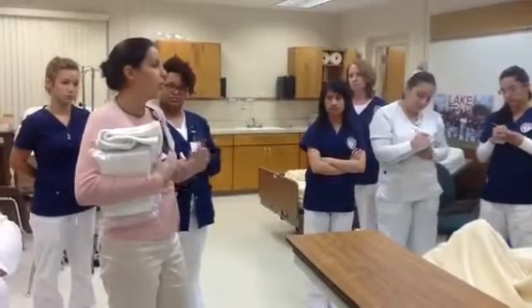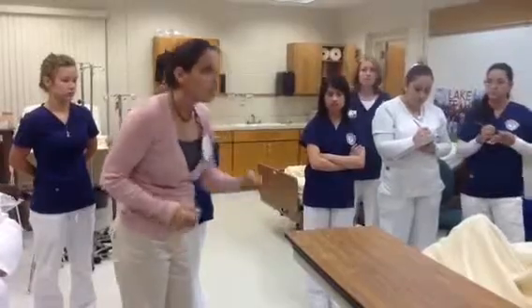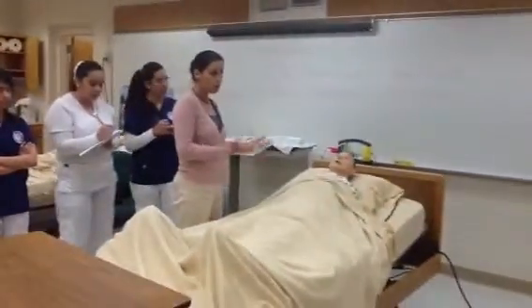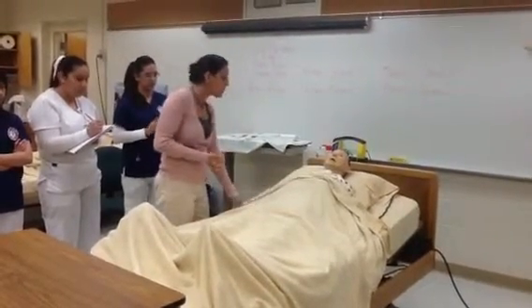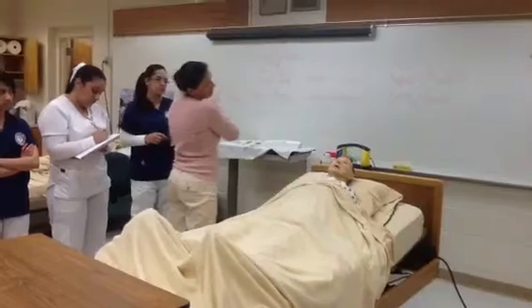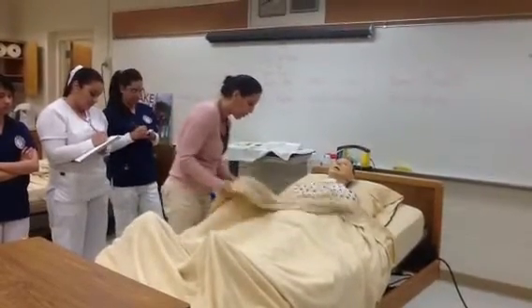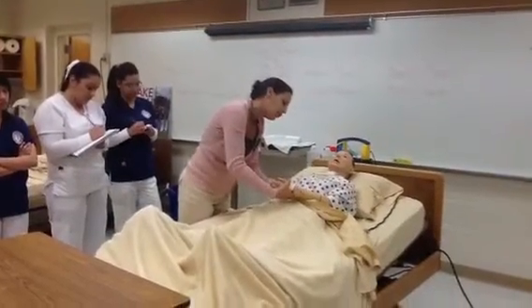Then I will go to the room, introduce myself to the patient, and explain the procedure that I'm going to do. In this case, Mr. Jones, how are you doing today? I'm washing my hands. You doing good? And I've already checked the name bracelet. It's on this side. Can you go ahead and tell me your name and date of birth?